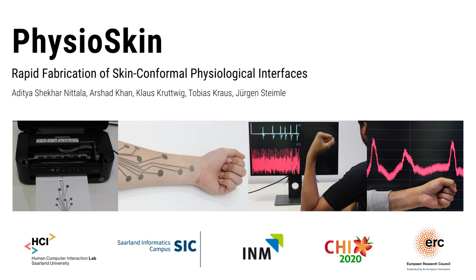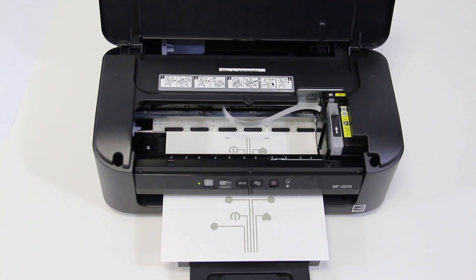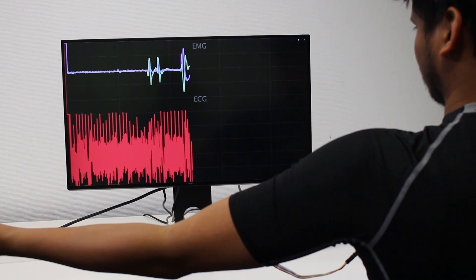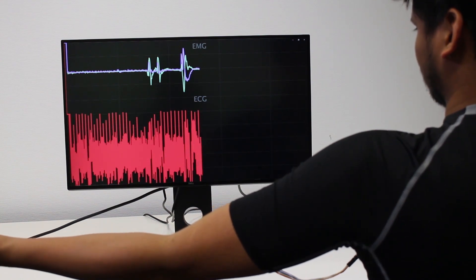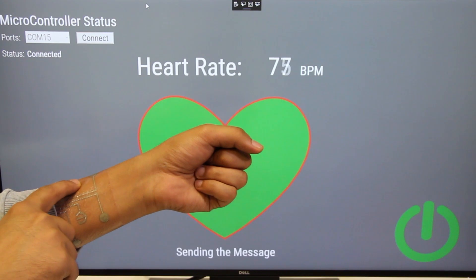We present PhysioSkin, a rapid fabrication method for realizing customized electrophysiological sensing patches for the human body. It uses a commodity desktop inkjet printer and commercially available materials. PhysioSkin devices can track multiple modalities or combination of modalities, and also supports embedding custom input controls within a physiological patch.